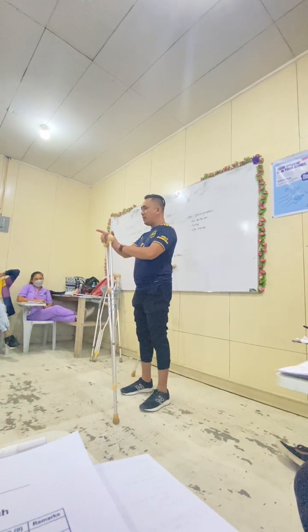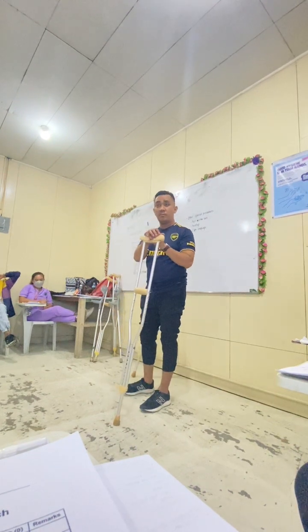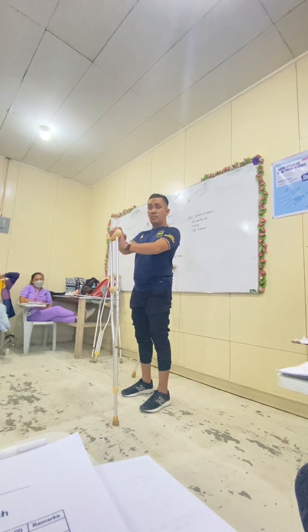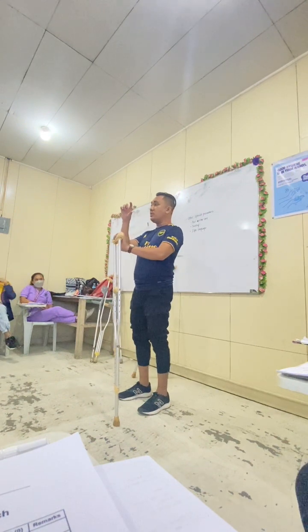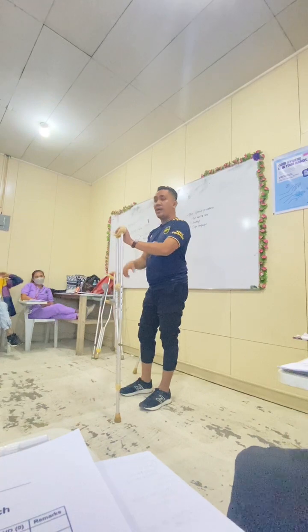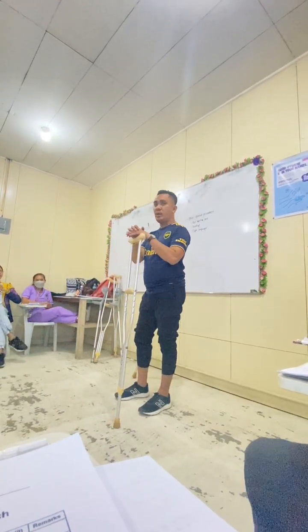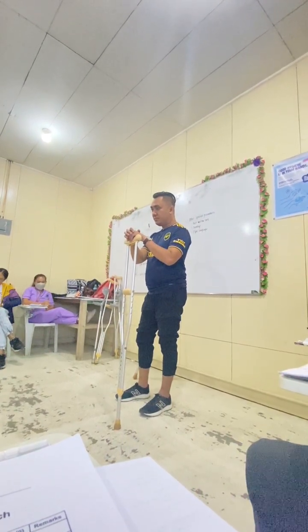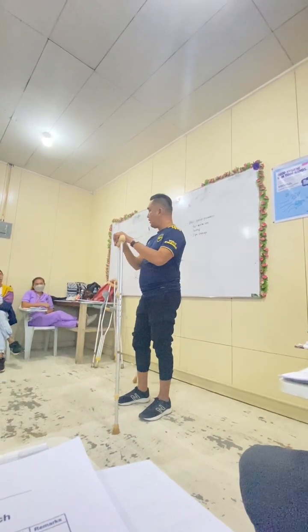Or, not actually subtract, some of the time you need to add. For example, mingon sila 5'5", but when you fit it, 5'6" siguro bagay sa mo, because some of them are wearing shoes or heels with inches. So the height of the patient increases, so try to add a little more. Next is place the top of the crutches under the axilla or armpit.